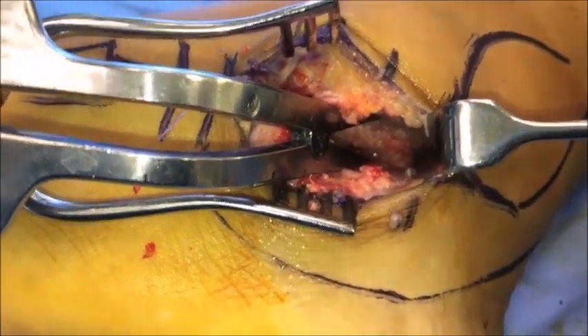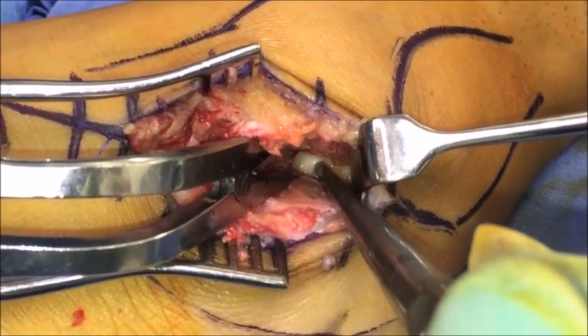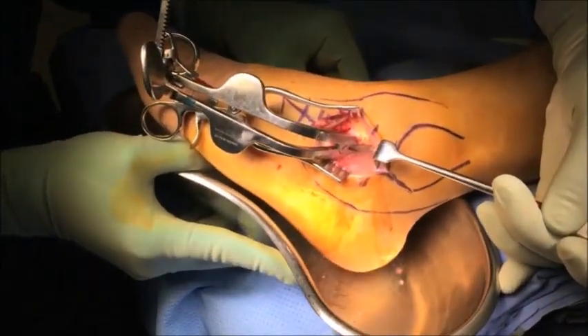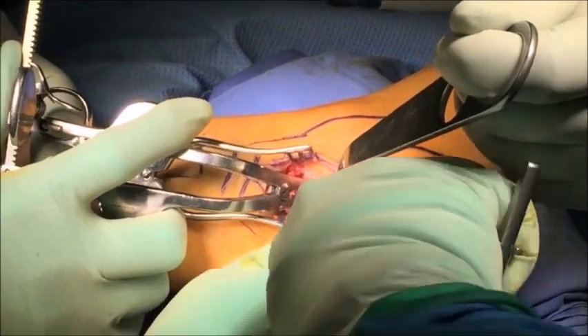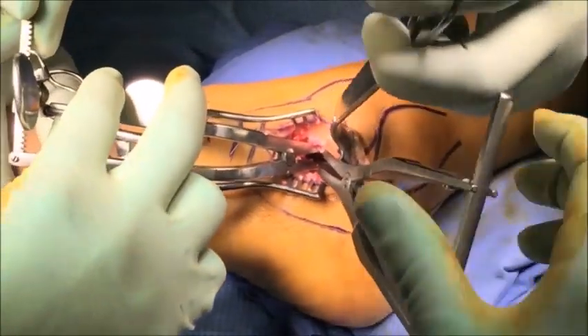For the purpose of this video we have used a spine curette to demonstrate the FHL tendon in the posterior medial corner of the joint. The joint is washed out with copious amounts of normal saline to remove all the small debris. Now that we are happy with the preparation of the posterior half of the joint, a lamina spreader is inserted posteriorly and the anterior one is removed.